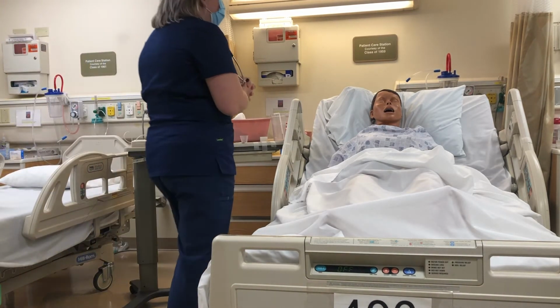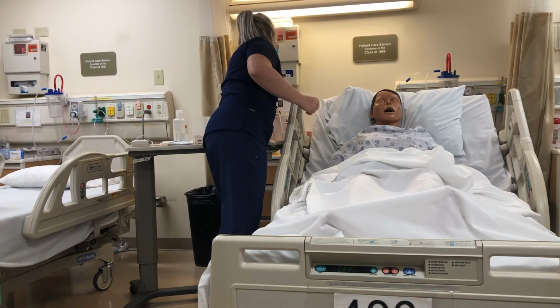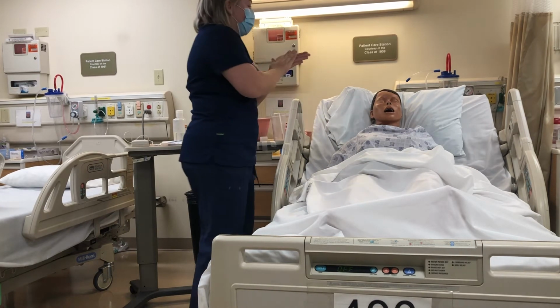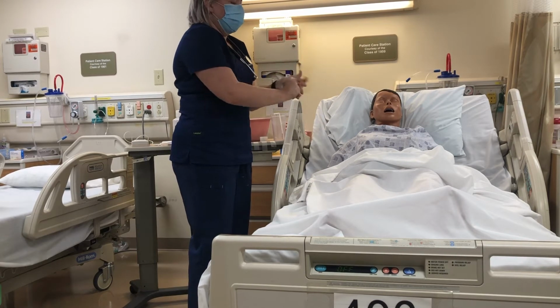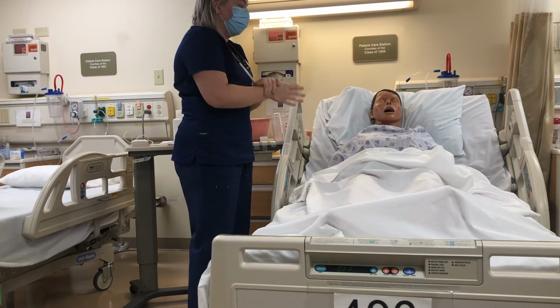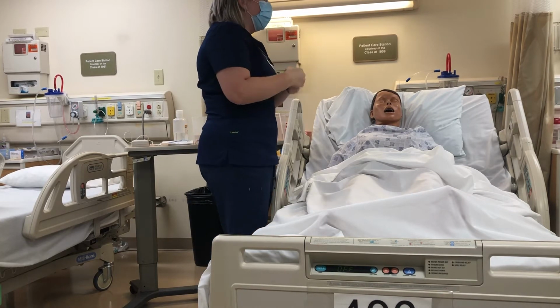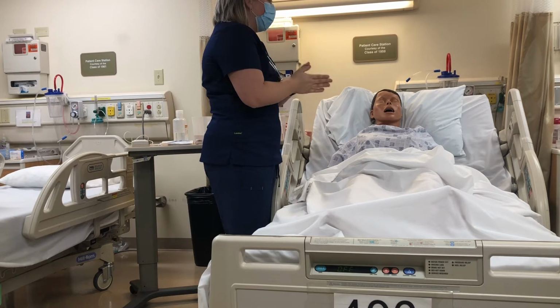Hi there, how are you doing today? My name's Audrey, I'll be your student nurse this evening. I am here to place an NG tube in your nose. I'm not sure if the doctor came and saw you, but he did place an order for an NG tube. I understand that your stomach's been super upset, so placing the NG tube will give your bowel a rest and hopefully it'll be able to heal itself.